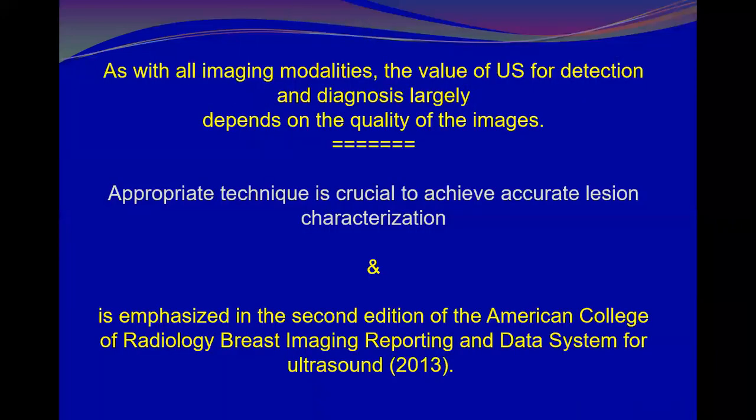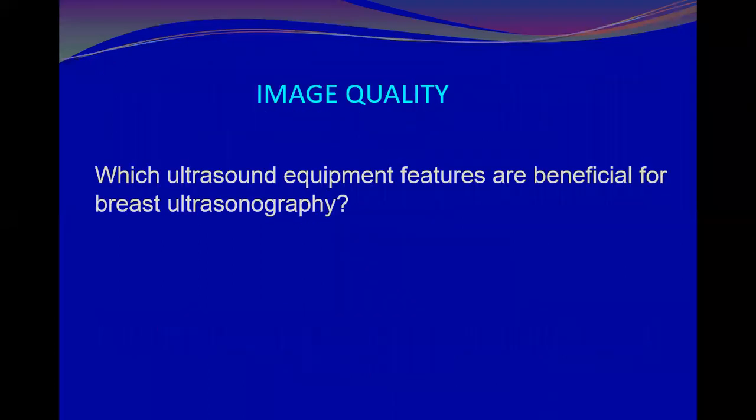Okay. As with all imaging modalities, the value of ultrasound for detection and diagnosis largely depends on the quality of the images. An appropriate technique is crucial to achieve accurate lesion characterization. And this is emphasized in the second edition of the American College of Radiology, ACR latest edition 2013.